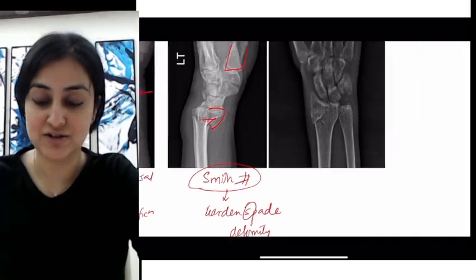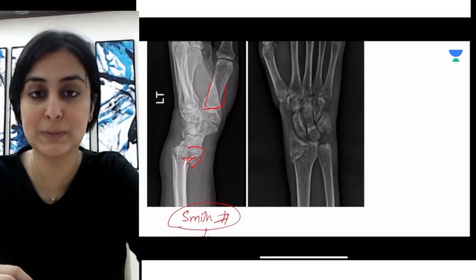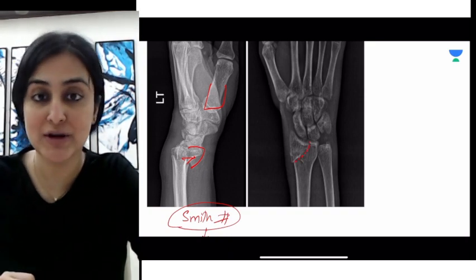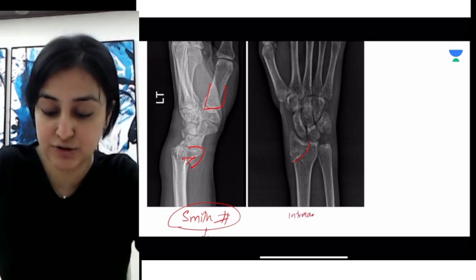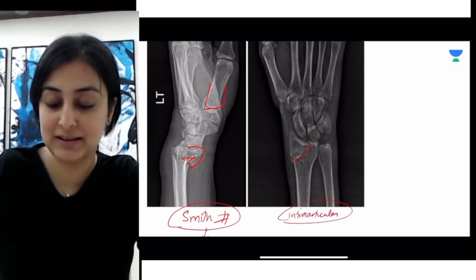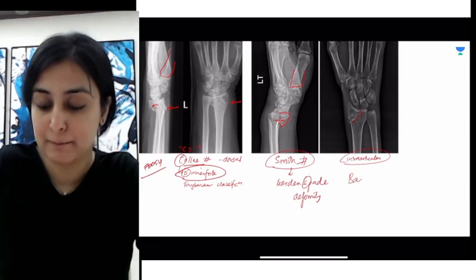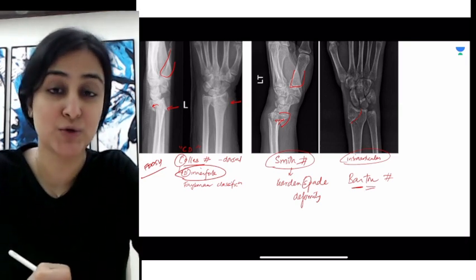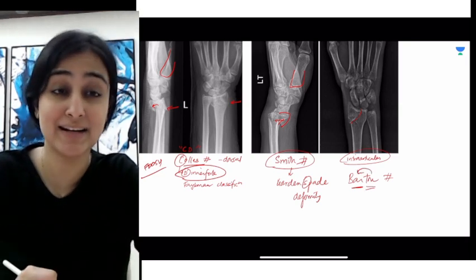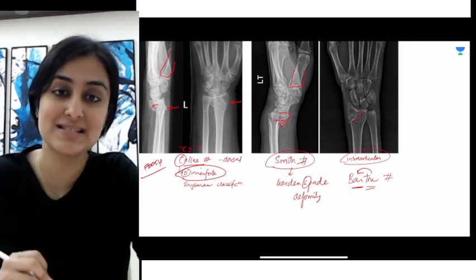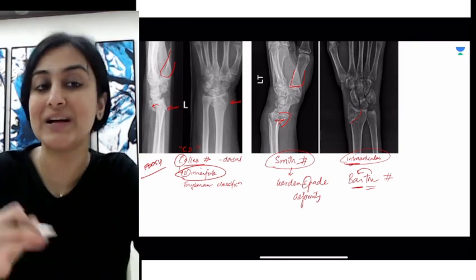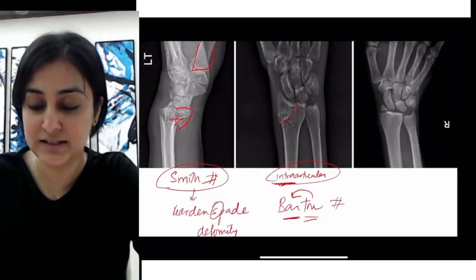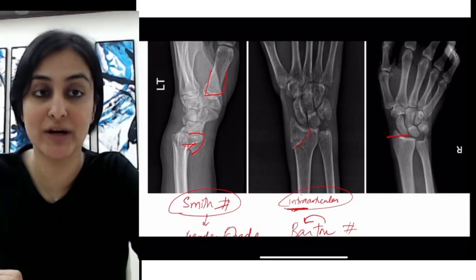Following this, we have a fracture that differs from Colles' and Smith's in that it is intra-articular — you can see how it extends into the joint surface. When you have an intra-articular fracture, remember this is called Barton fracture. The mnemonic: when you want to drink a ton of alcohol, you go inside a bar — you can't get it outside. So remember, you have to go within the joint: intra-articular is Barton fracture.